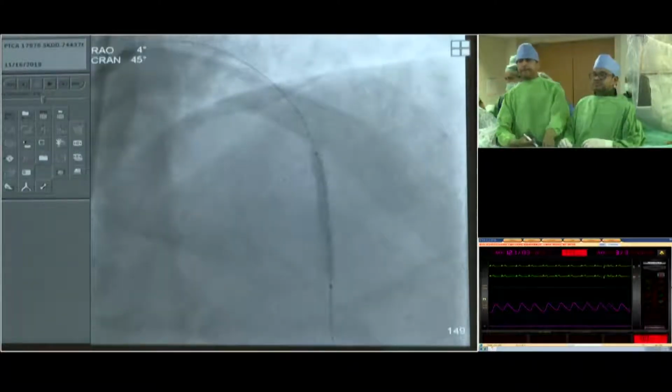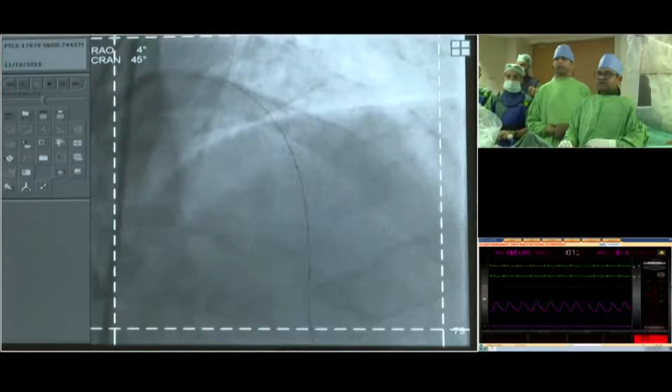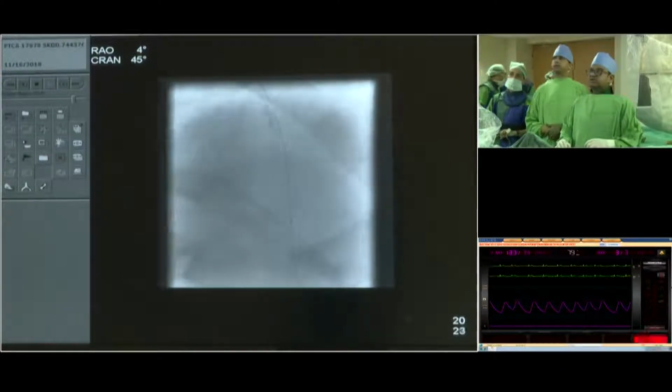Slow down. Negative, please. Can we show it on the stent boost? Stent boost, please. And collimate it. Can you show the stent boost? Fluoro, please. It helps in finding the markers on the stent boost quite easily. Ready? So can you show the stent boost on the screen?